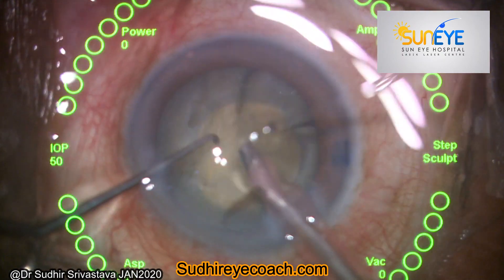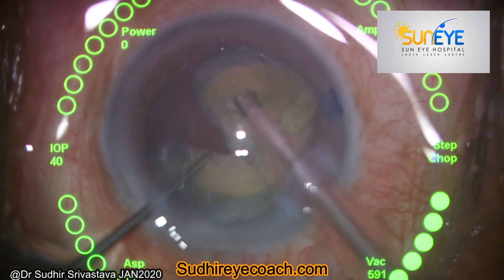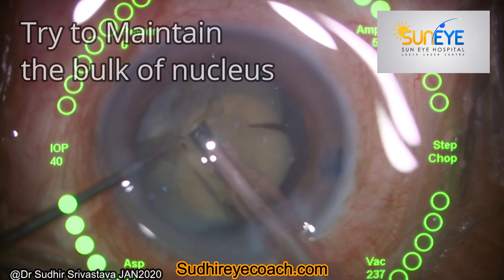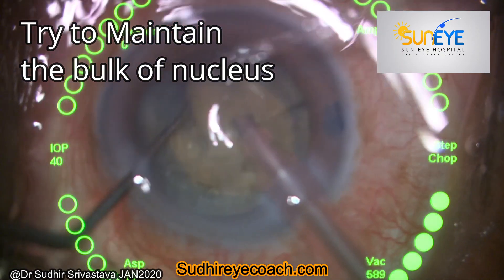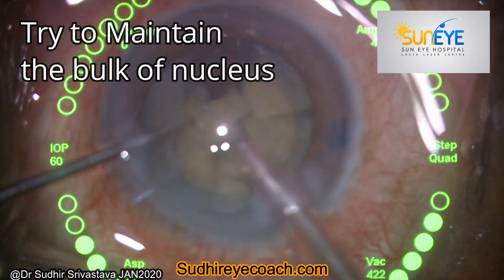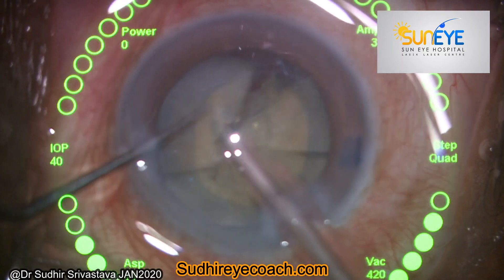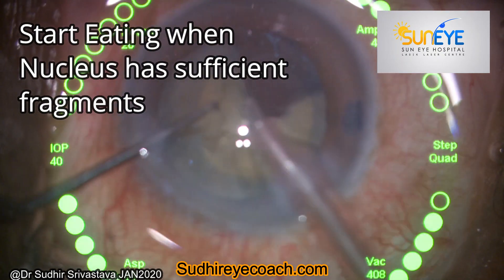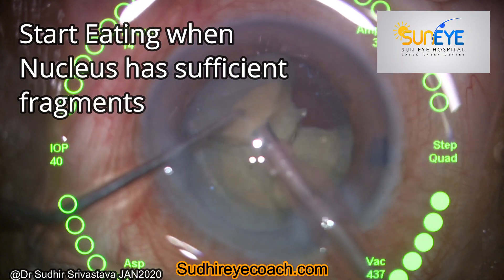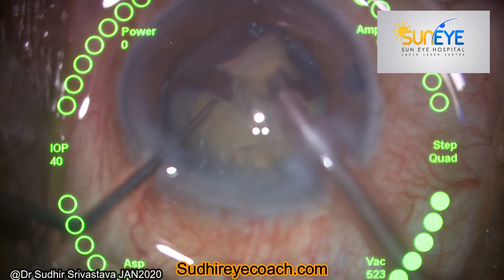This is the time where you need to maintain your patience. Rotate the nucleus in different areas, hold it, and do chopping to divide it into small fragments. Once you are sure you have divided the nucleus into smaller pieces, you can bring a small piece to the level of the iris plane and finish your phaco fragmentation at that level.